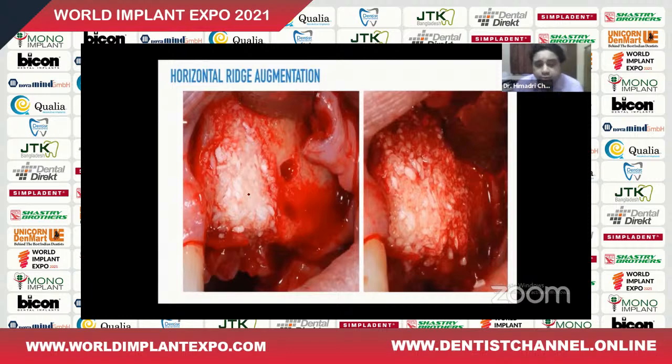But remember, when you are choosing an allograft, make sure that it's an FDBA, not a DFDBA, because DFDBA is demineralized and it's only a bone morphogenetic protein source. So it vanishes in no time. After 3 months, you will come and see there's complete volume collapse. So DFDBA or DMBM is not the material for volume augmentation. You require FDBA, or freeze-dried bone allograft, which is not demineralized. So you require a cortical graft, not a cancellous graft, okay?